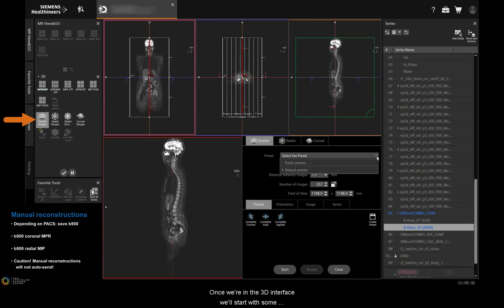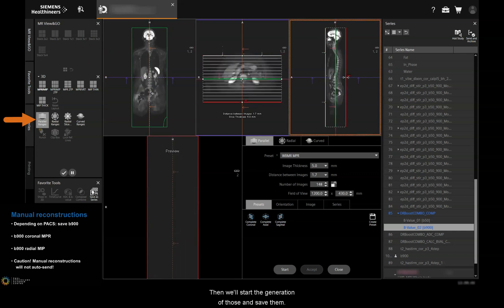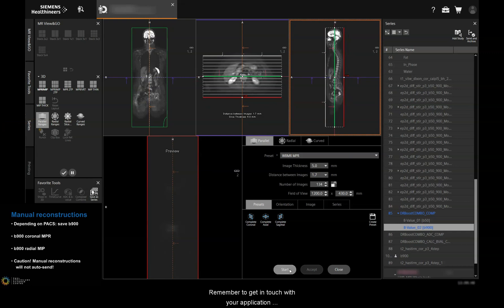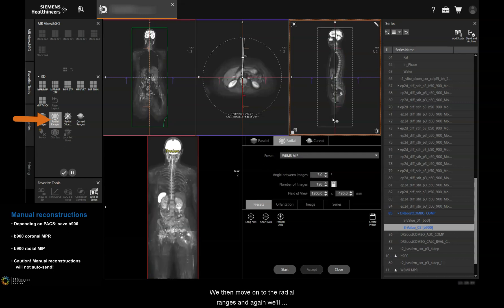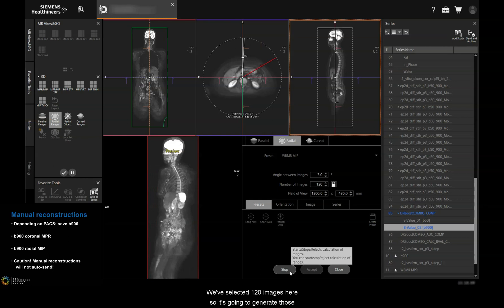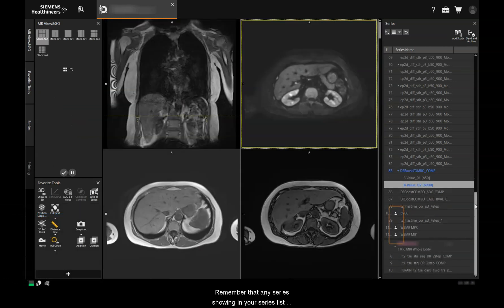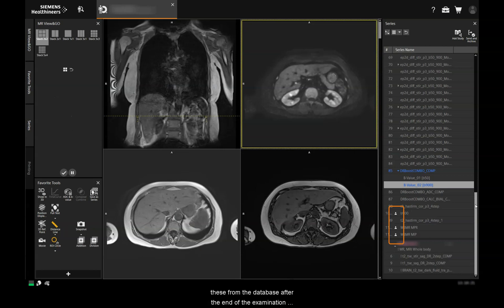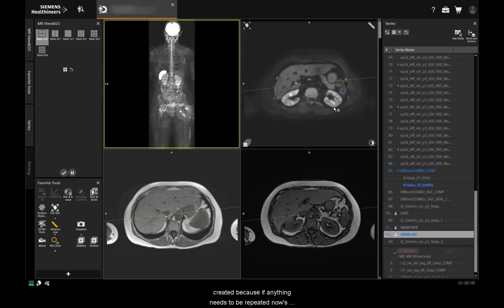Once in the 3D interface, we'll start with some parallel ranges using a preset we've already created — effectively the complete coronal setting — and start the generation of those and save them. Remember to get in touch with your application specialist if you need any help setting these up. We then move on to the radial ranges, using the long axis preset with 120 images selected, and we'll save those and send them to PACS. Remember that any series in your series list with a little white man icon means they're manually created series and won't be automatically sent — you'll need to manually send these from the database after the end of the examination when you've chosen save and pause. I go back and check those images that have been created because if anything needs to be repeated, now's the time to do it.